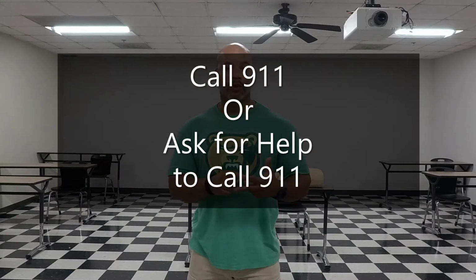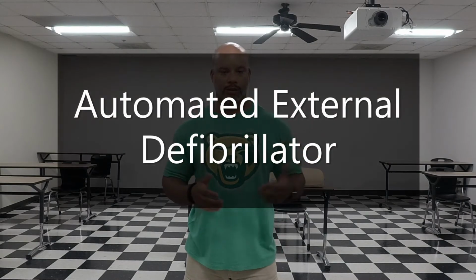The next thing is going to be the call. That's when you call 911. If you can't call 911, you tell someone to call 911 for you. In the process, you tell them to bring you back an AED. The AED is the automated external defibrillator. It's a device that will help get the heart rhythm back.